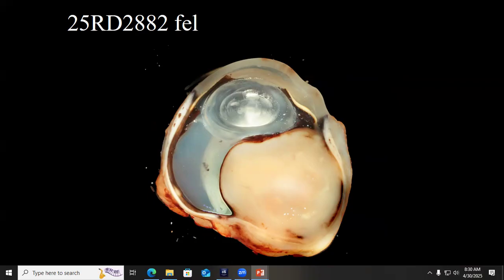Yeah, I think Kelsey grows this one. Yeah, this is a memorable one. She says, I did. So this is a 7-year, 3-month-old neutered male Singapura cat. Very cool breed.